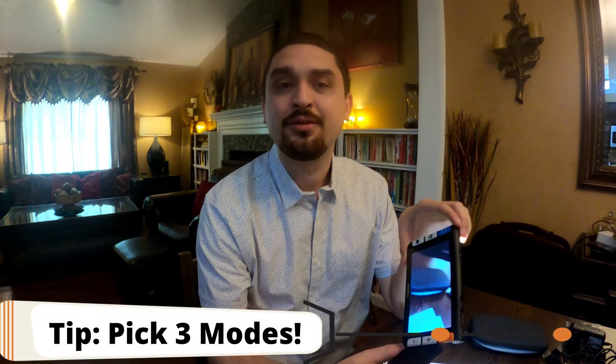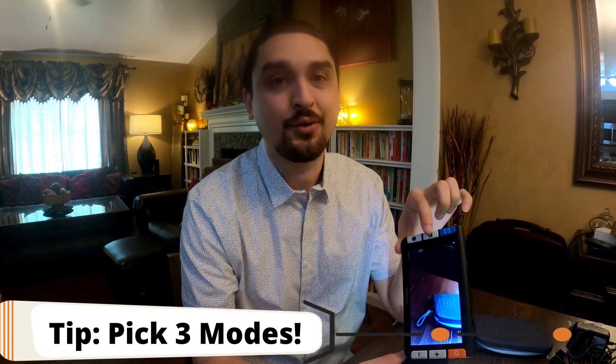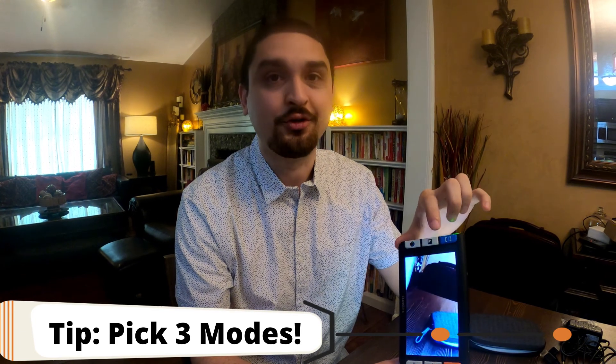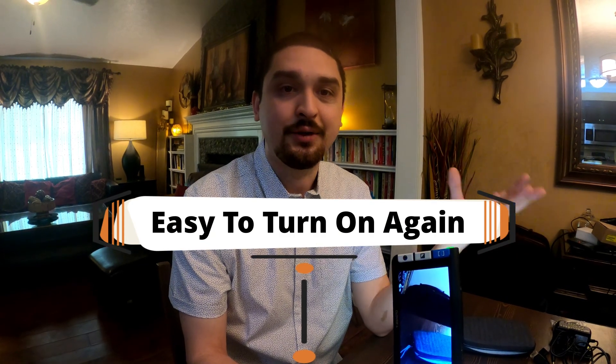One complaint on this one, and I found this on most video magnifiers, is there is no up-down arrow to quickly go through the contrast settings. You just have to push, push, push until you get to whatever color you want. So if you were using this for personal use, I would pick maybe three modes you like and disable the rest — that way you can get through them quicker.